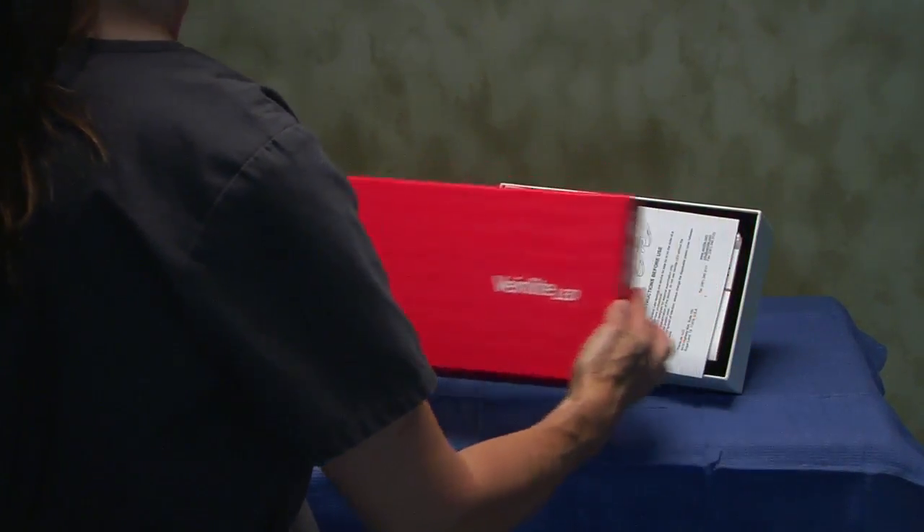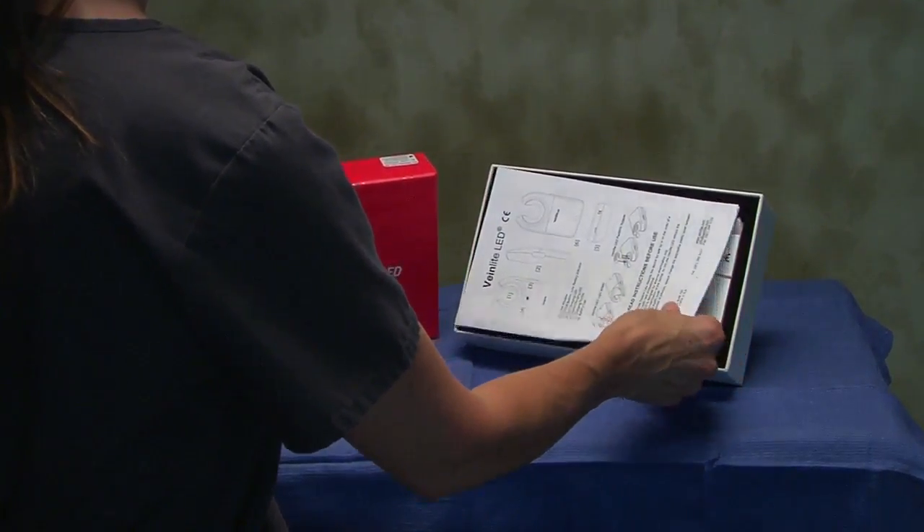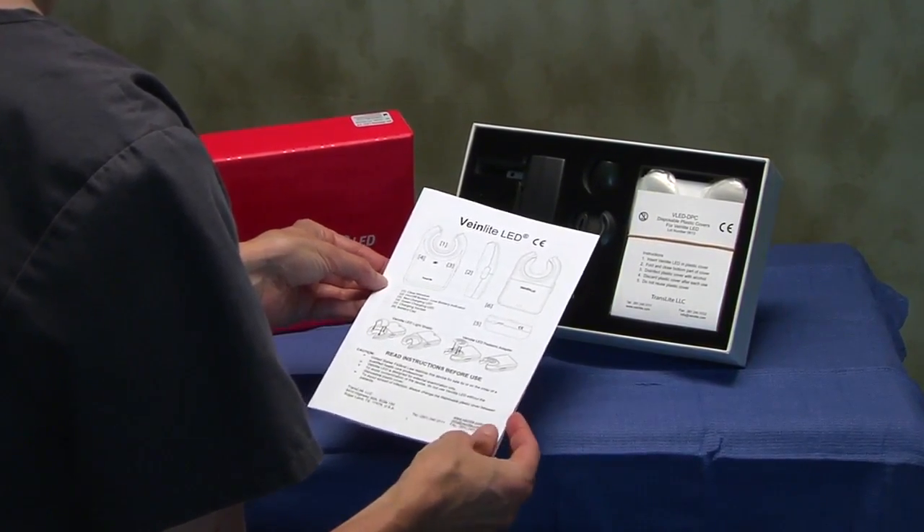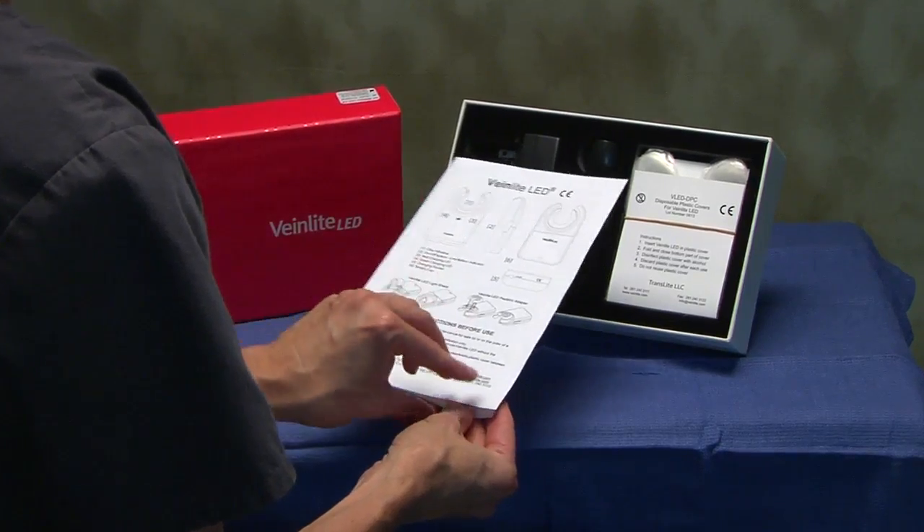When you open your VeinLight kit, you will first see a detailed user's manual. Please review the manual carefully for proper operation and maintenance information before using your VeinLight.